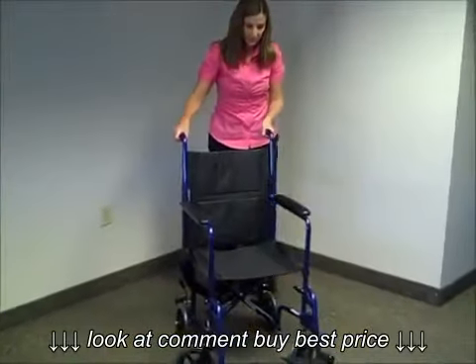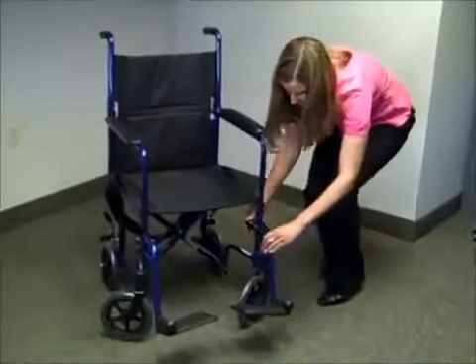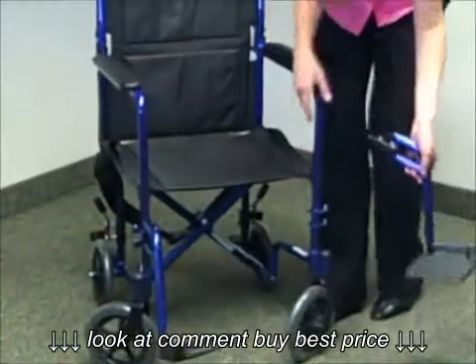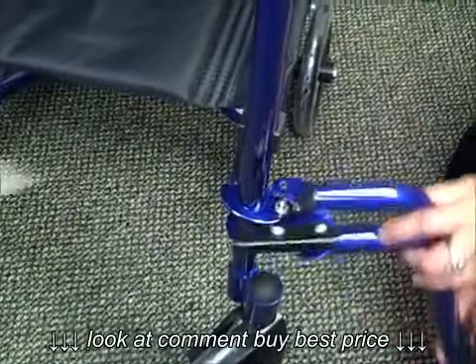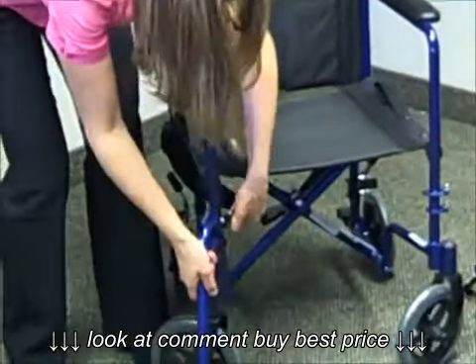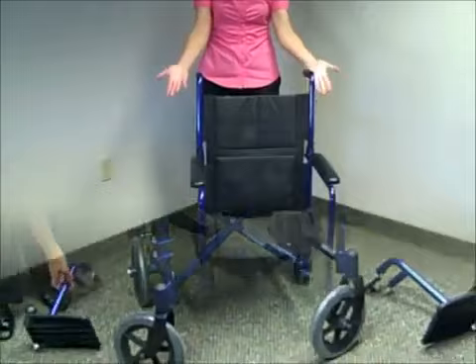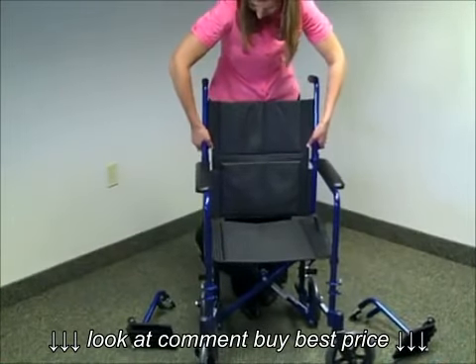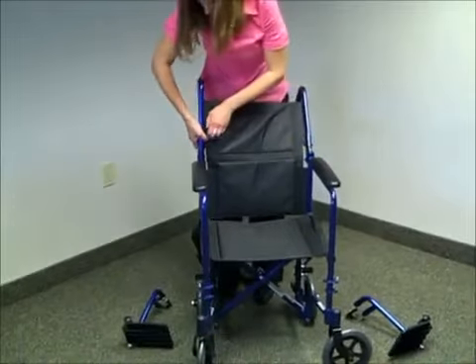To get it ready again to transport, first you want to remove the leg rest. Notice there's a black lever, just go ahead and pull that and remove the leg rest. Do the same to the other side. Next we want to fold down the back of the seat, so we're going to grab onto the black levers in the back and fold those down.